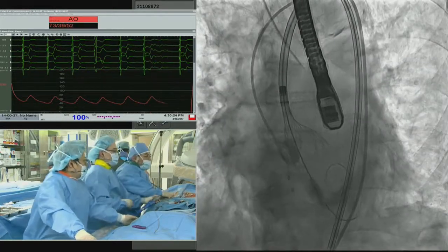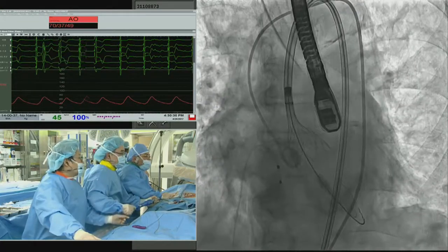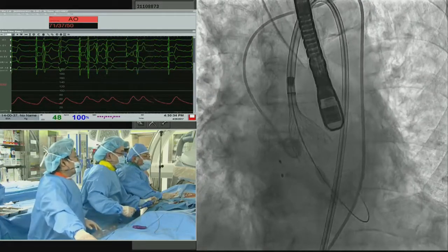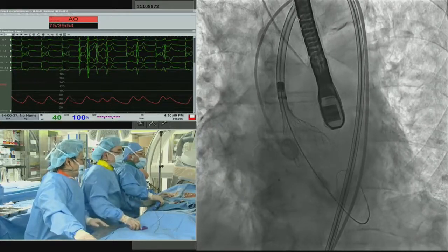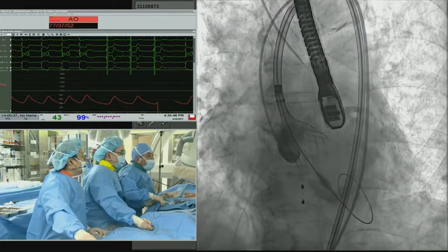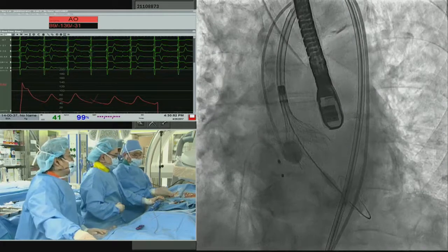In the first case, it looked like the central leak was there, and now it looks more like PVL on the left side. I think the position is a little bit higher, maybe 2 millimeters, and I think it's enough. If you try to be higher, it will be very difficult. Yeah, that's not much of an AR, it looks like, huh? Yeah, it's not good. Recapture again.